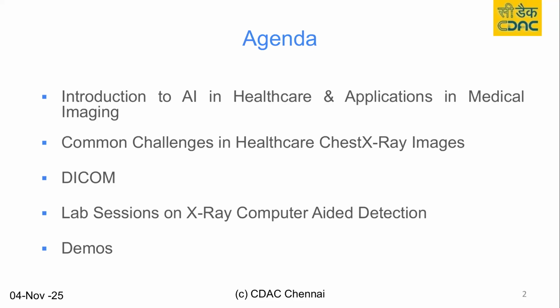So this is a standard used widely in healthcare for transfer of X-ray images. Any images, medical images. Similarly, there are some standards like EHR, Electronic Health Record standard. So the standards are there for any medical image communication part. For the imaging part, the DICOM standard is a worldwide accepted standard.